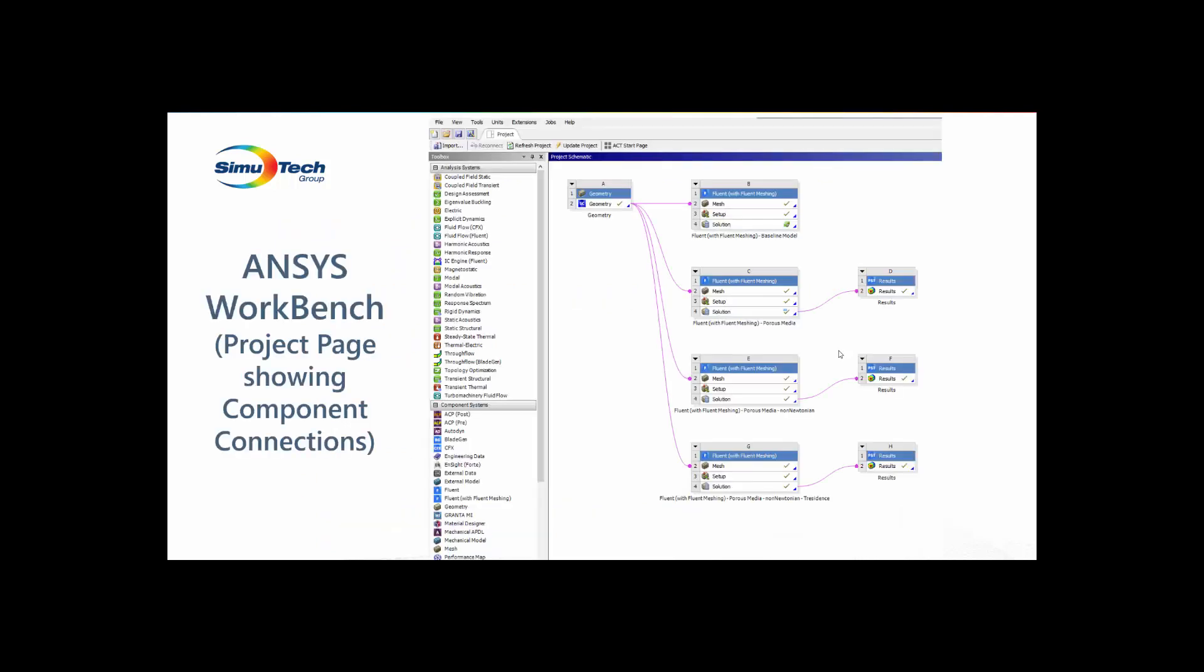This is the Workbench project page, which is used to connect the different analysis components. I really like the project page. It's easy to see how everything is interconnected. As shown on the left-hand side, there are many different analysis systems to choose from, with the individual component systems listed below. For this model, I'm showing a Space Claim Geometry component linked to several different Fluent with Fluent Meshing components. These are in turn linked to several different results or CFD Post components.